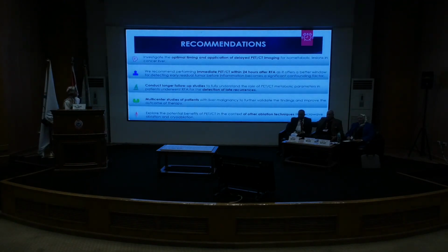Recommendations: we need to investigate the optimal timing and application of delayed PET-CT imaging for isometabolic lesions in cancer liver. We recommend performing immediate PET-CT within 24 hours after RFA, as it offers a better window for detection of early residual tumor before inflammation becomes a significant confounding factor. Conduct longer follow-up, multi-center studies of patients to validate the findings and improve the outcome of therapy, and finally explore the potential benefits of PET-CT in the context of other ablation techniques like microwave ablation and cryoablation.